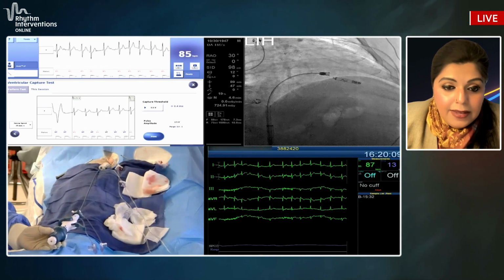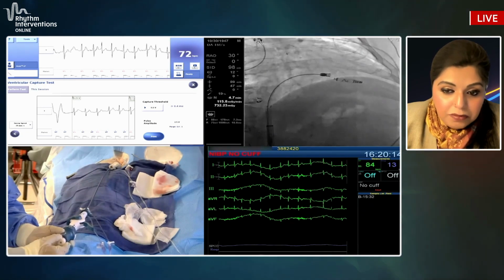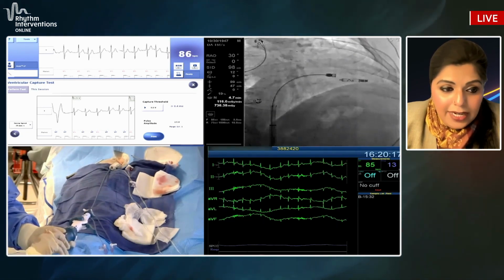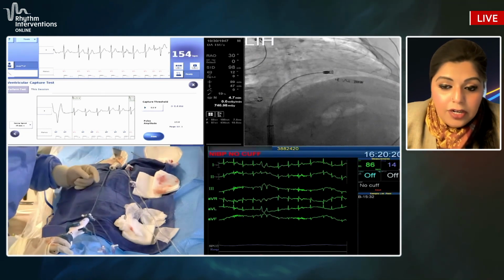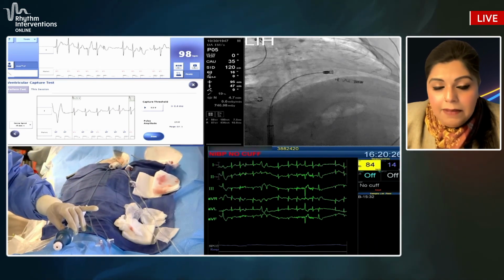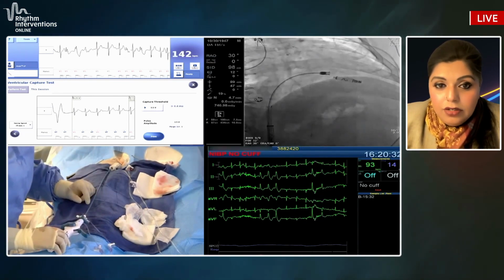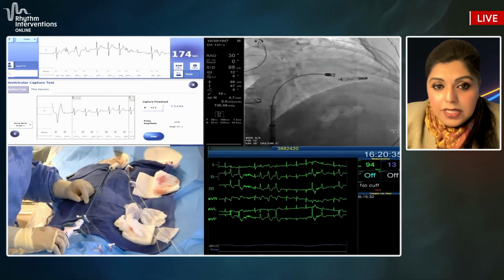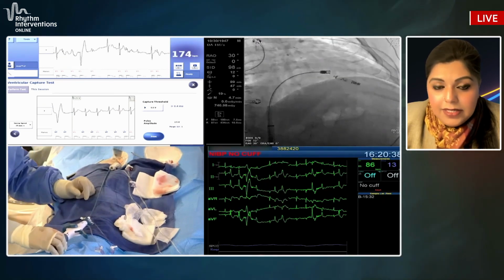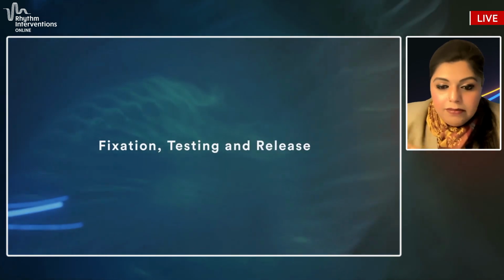So what you do is you brace the delivery catheter handle and the blue control knob with your left hand. And I'm going to pull the release knob, the white handle, away from the blue knob, and turn it counterclockwise, just a half turn counterclockwise, and that releases the device there. Sometimes it doesn't release with that 1 turn. You saw that in this case, as I turned, you'll see it in the videos replaying here, you'll see it release, and it's pretty evident when it releases because they both start moving in different forms. So sometimes you kind of have to wiggle it around a little bit. You have to move the knob a little bit, but most of the time it'll release pretty easy.